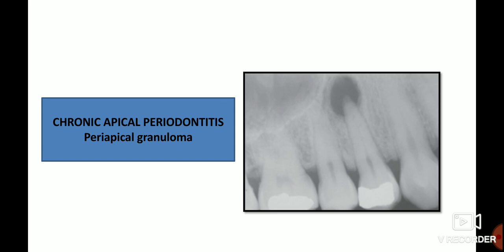A well-defined coronal radio-opacity is seen involving enamel and dentin and approaching the pulp, which is suggestive of metallic restorative material. The alveolar crest is at 1.5 mm below the level of the CEJ. The root portion shows loss of lamina dura all around the root surface. In the periapical region, there is a well-defined radiolucency of size less than 1.6 cm, not lined by a radiopaque border, which is suggestive of infected periapical granuloma.